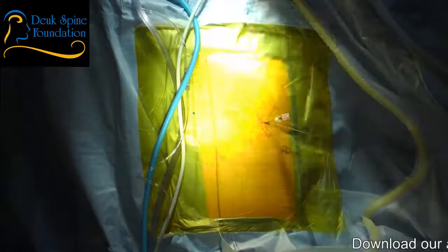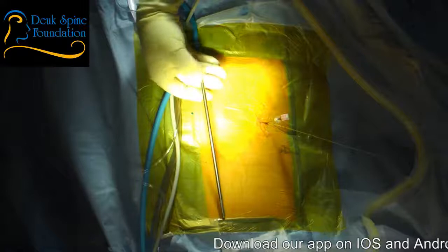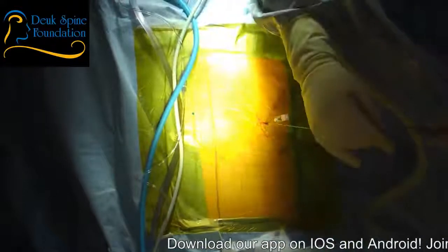Okay? You can see everything is being done with a 7mm incision. I'm going to bring the dilator down. It looks like a big metal pencil along the guide wire.